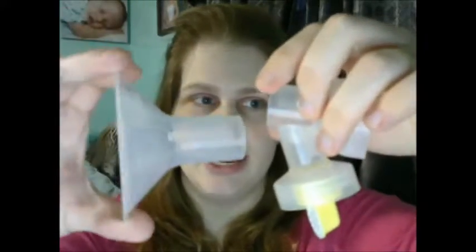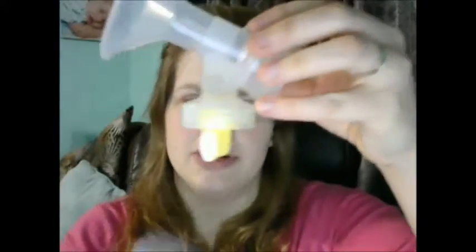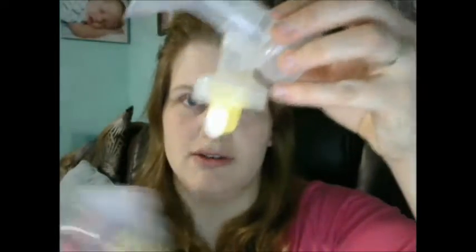With my Pumpin' Style pump, I received this flange — it's a small size, but that's what came with it. And I don't know what this part is called, but then there's the membrane and the valve, which obviously all screw into your bottle.